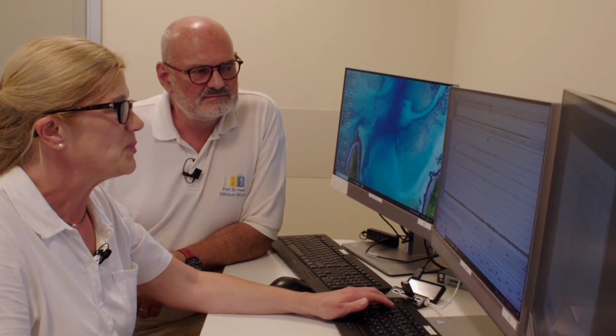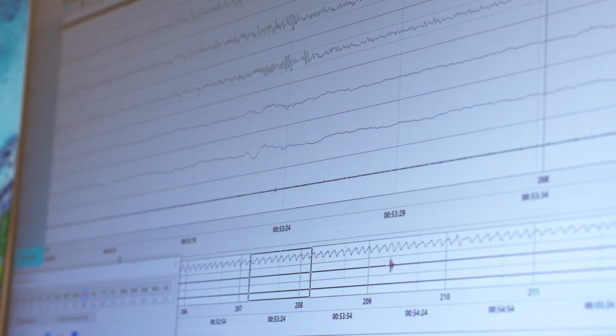What we see here is the automatic analysis of the device. It always does a pre-analysis, but if you're a pro, then of course you would correct it now. Exactly, correct it. And that's perhaps also the point why it's so important that we humans are still here in the sleep lab, because the robot can't do it alone yet. No. It has very clear algorithms, but here he has now fallen asleep. But we see a frequency acceleration here back to a beta.